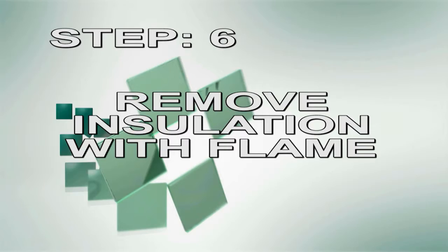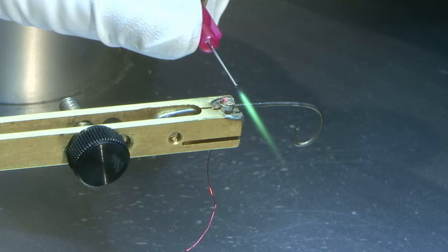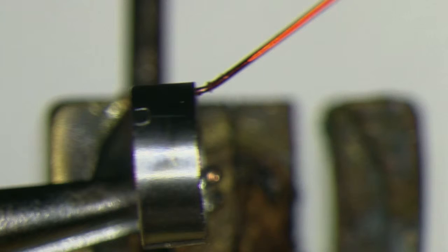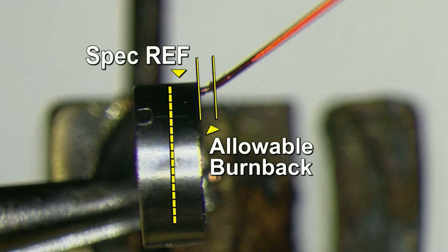Step 6. Remove insulation with flame. Apply the torch flame to the top middle of the ring to remove the insulation from the wire. Insulation should not be melted away or burned back more than half the height of the ring.